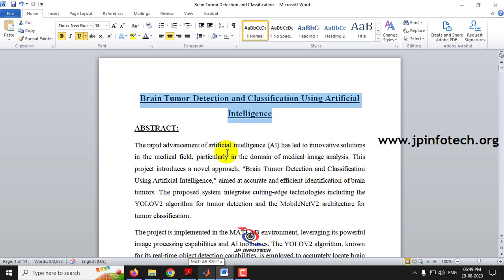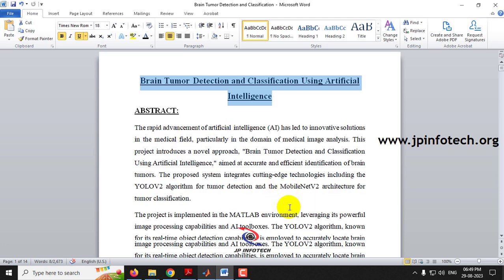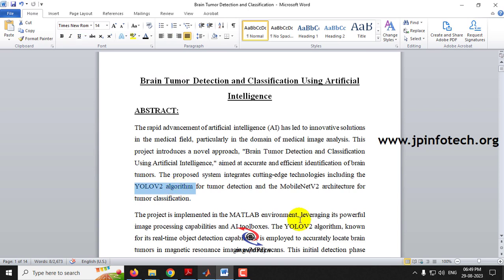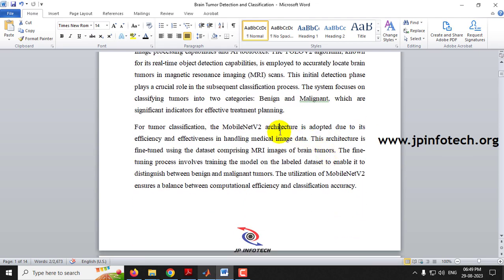Early detection of brain tumors will help protect human lives and benefit patients. In this project, we are going to implement brain tumor detection and classification using two different models: YOLOv2 algorithm for brain tumor detection, and MobileNetV2 architecture for tumor classification. The project is developed in the MATLAB environment with two classes — benign and malignant.